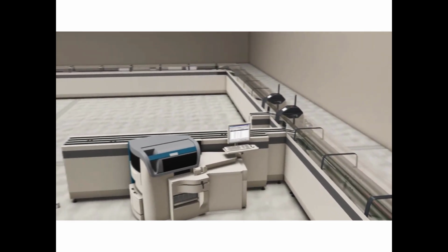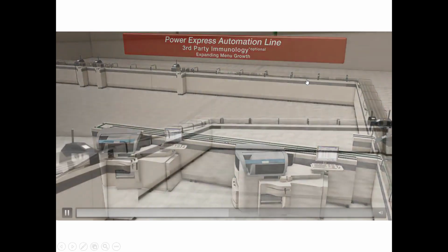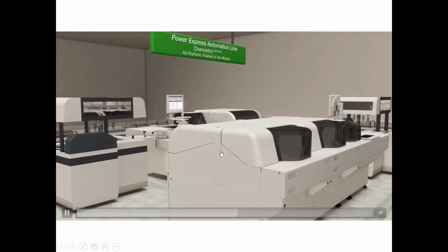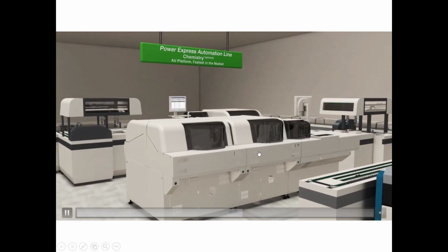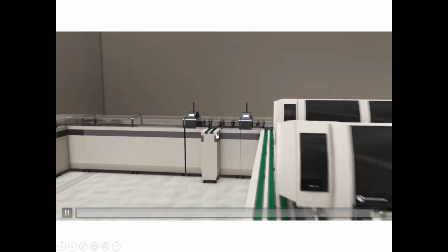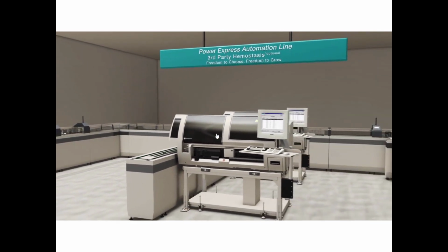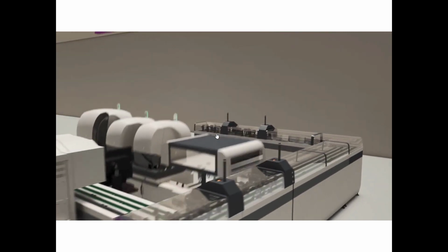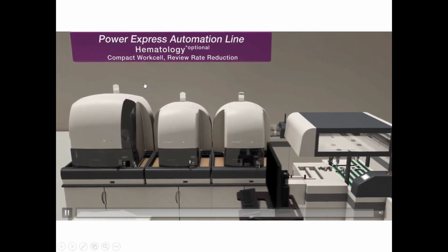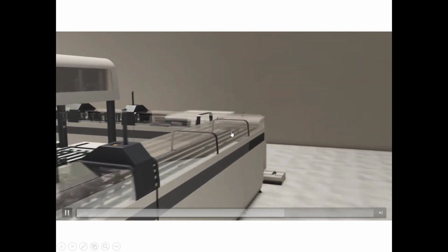Also, the analytic phase is automated, and the post-analytic phase is also now fully automated. So we can see the different tasks in the pre-analytic phase, and the different types of analyzers: chemistry analyzer, hematology analyzer, coagulation analyzers, all of them. And we will now see the post-analytic part.